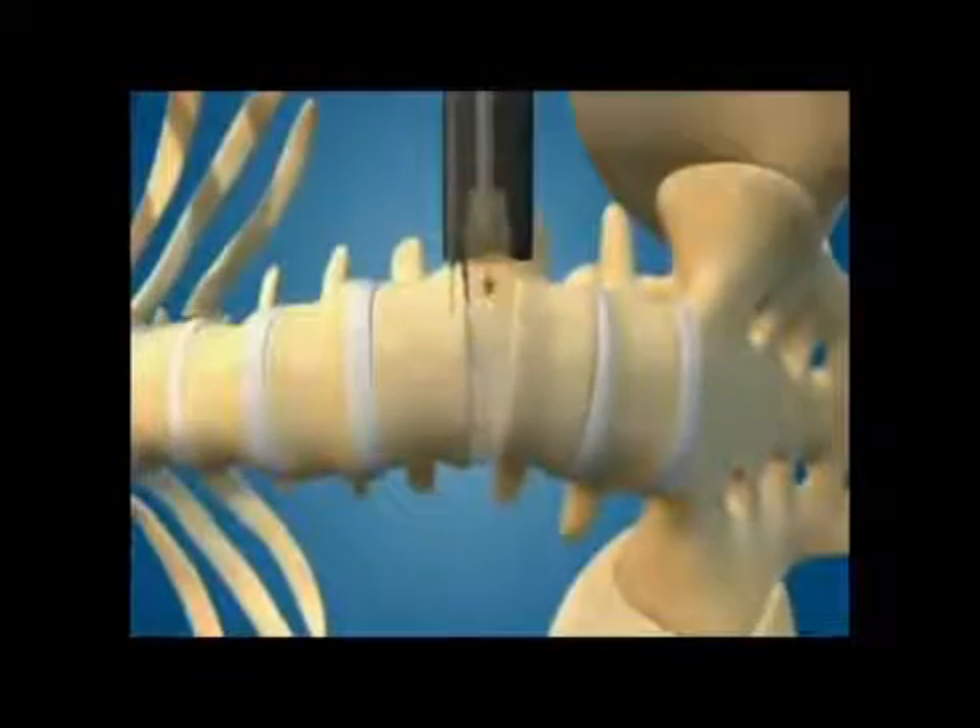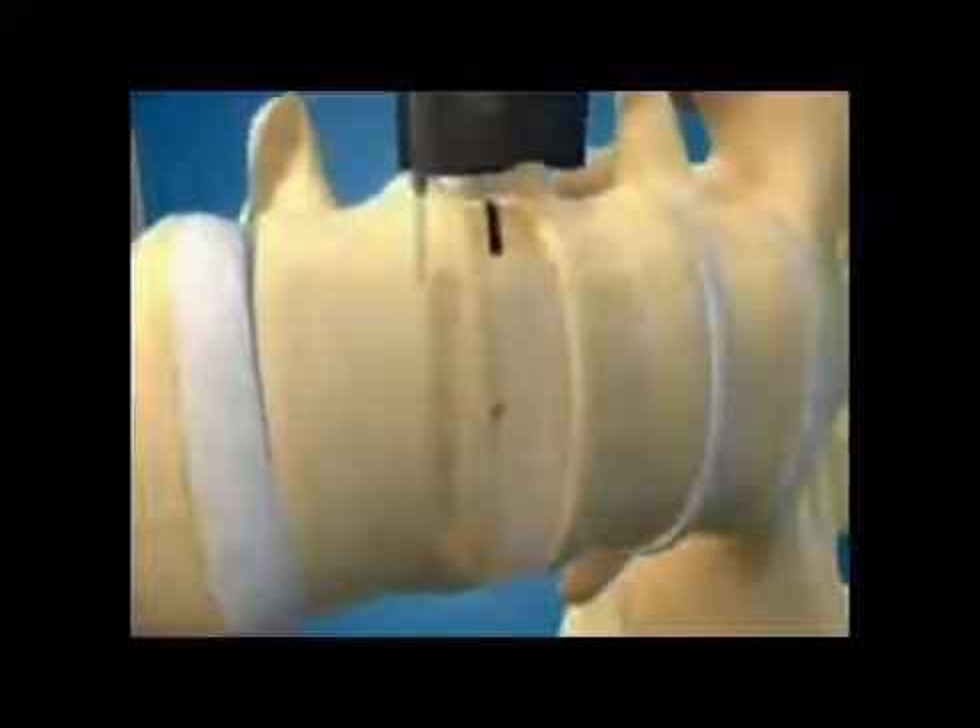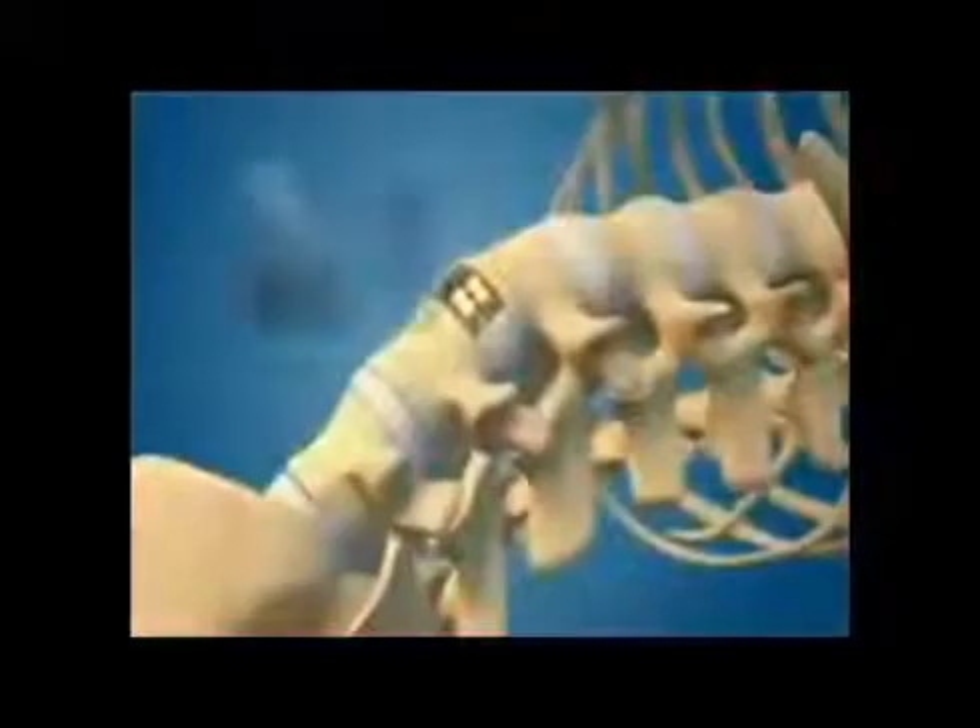The implant with bone graft is then inserted through the opening, allowing for the spine to be distracted at the disc space again under direct visualization. The port is then removed and the incision is closed.